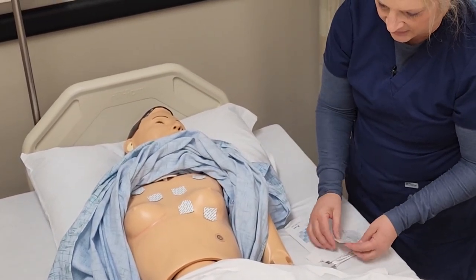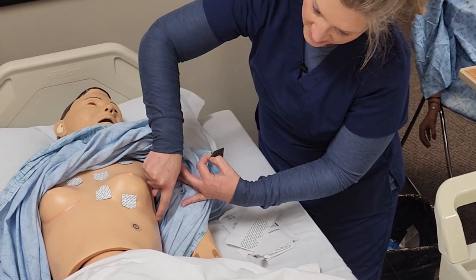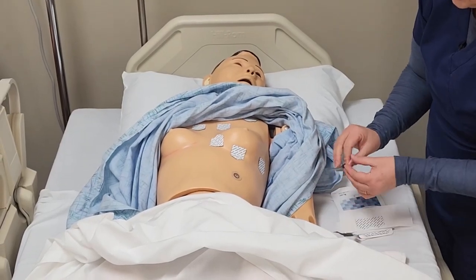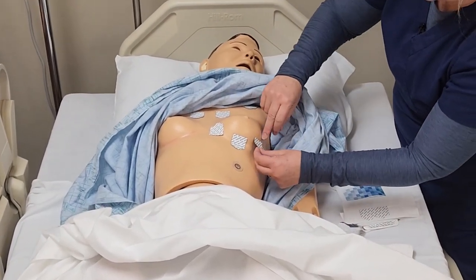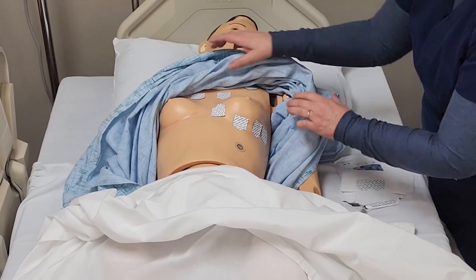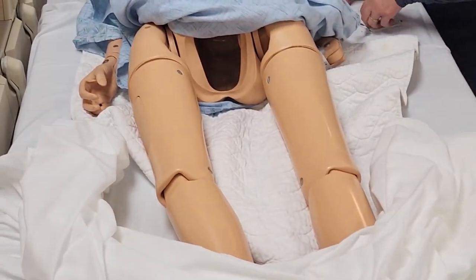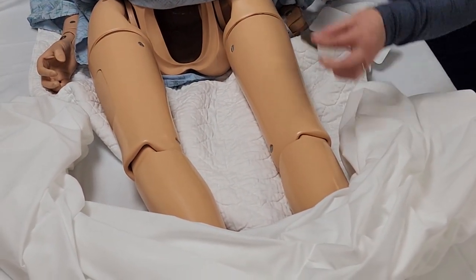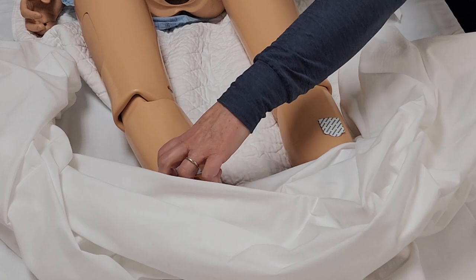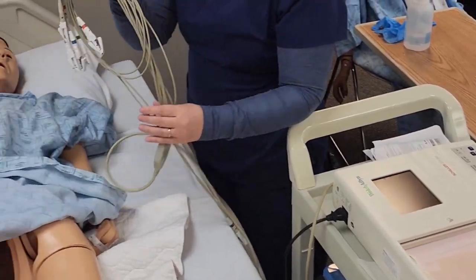Then we're going to find V6, which is mid-axillary — in the mid-axillary line. Our V5 is going to be at the same level as V6. Then we're going to go ahead and use our lower extremities for our ground leads, placing one on the left and the right shin. Once we have all of our electrodes placed, we can go ahead and hook up the EKG wires.